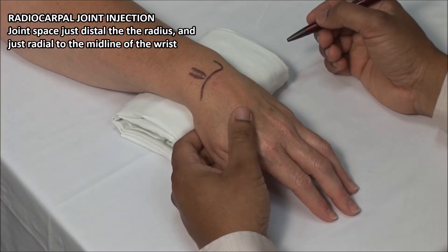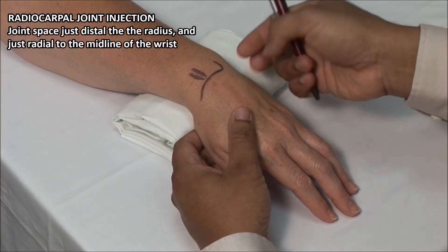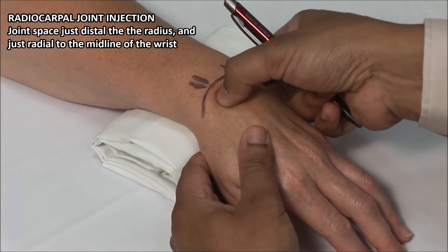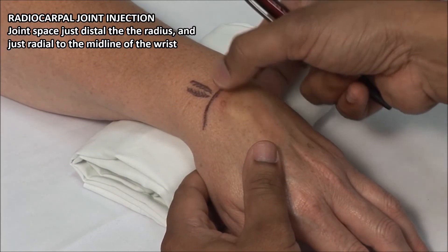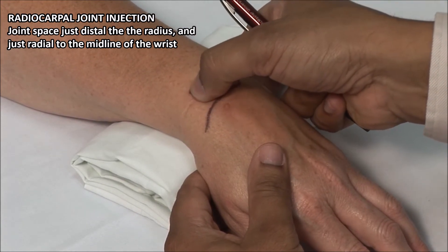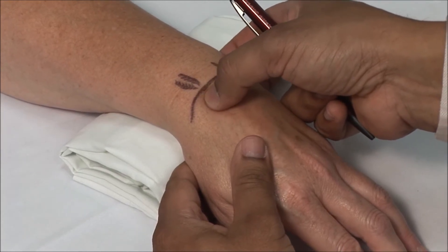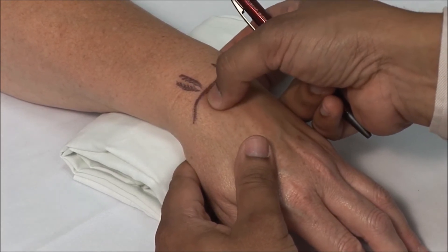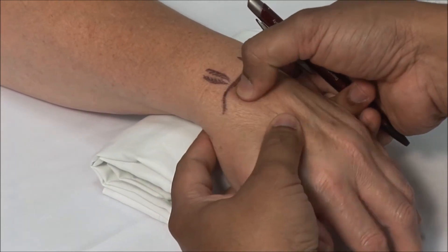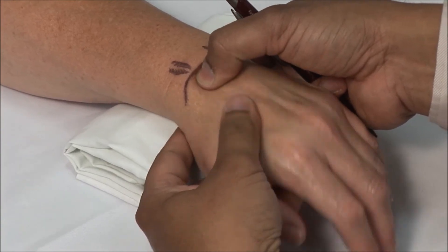Radiocarpal joint injections are done through the soft spot just beyond the radius. This can be found by palpation. You can also identify this by palpating for Lister's tubercle, highlighted here, and then letting your thumb slide distally into the joint space. You may have to flex and extend the wrist to fully appreciate the joint space.